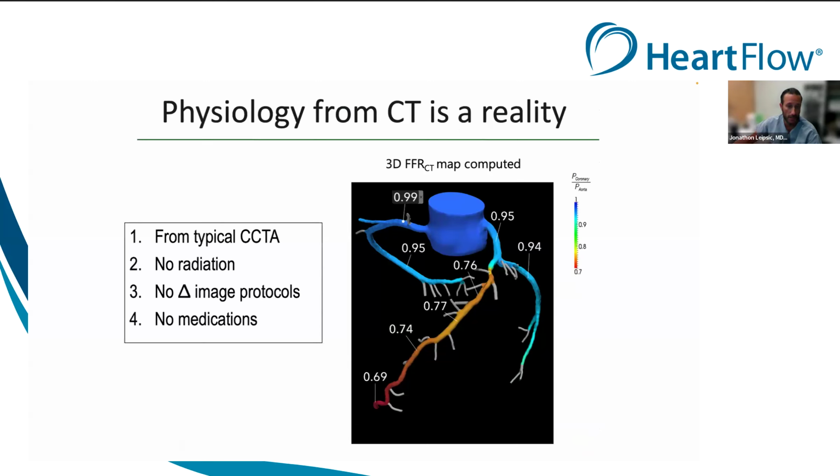And importantly, the technology we saw at that time was one that allowed for point-specific physiological adjudication of pressure, lesion-specific pressure, focal pressure calculation distal to any individual lesion. And it's that information that we've learned over the last 15 years that is fundamentally important to informing medical management, informing the need for referral to the cath lab, and enriching the cath lab referrals such that patients who go to the cath lab are more likely to be intervened upon.